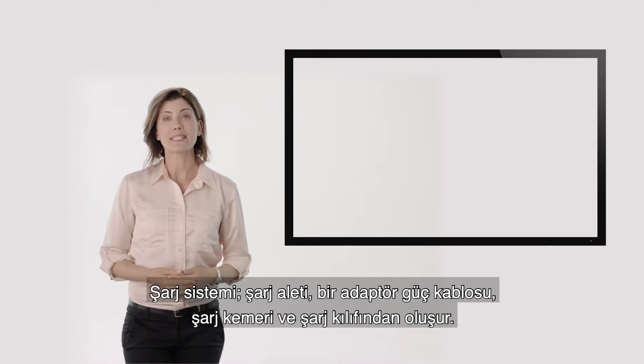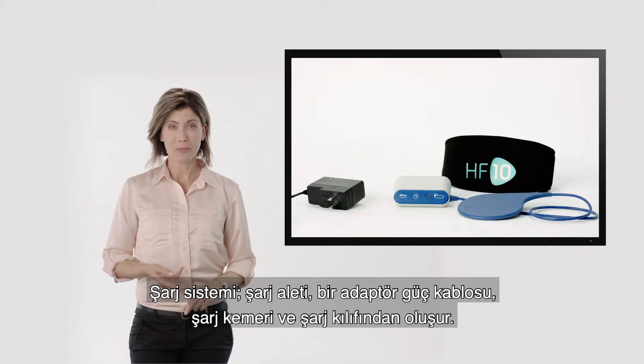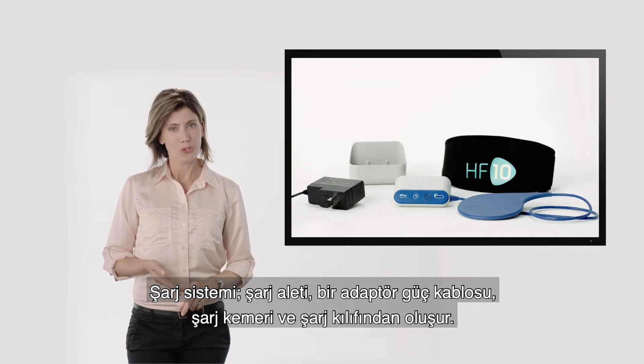The charging system consists of the charger, an adapter power cord, a charging belt, and a charger holster.